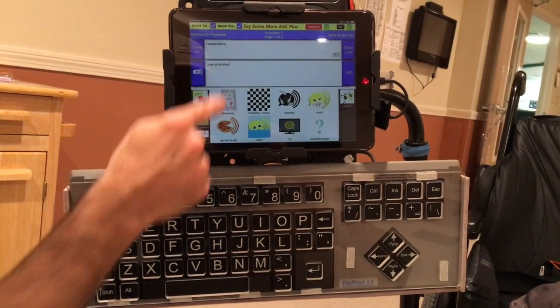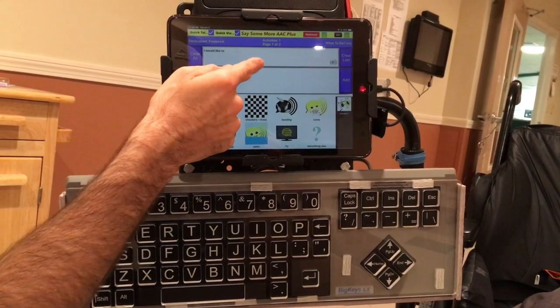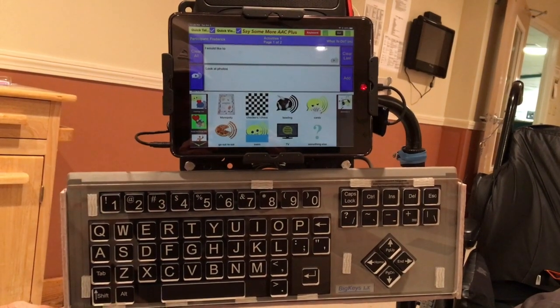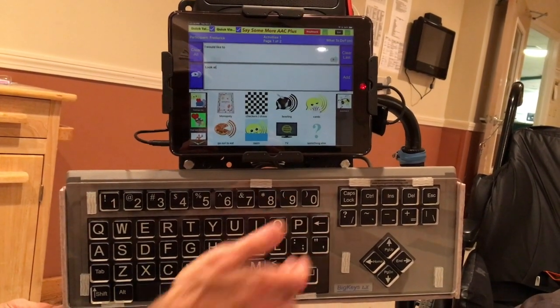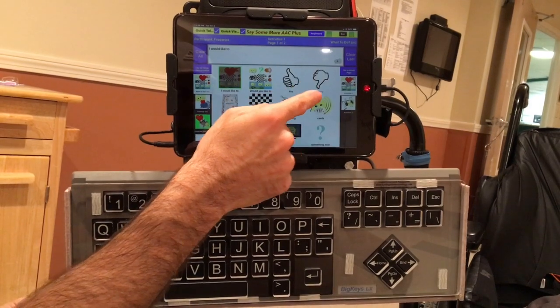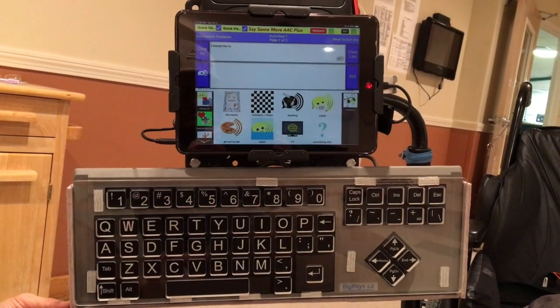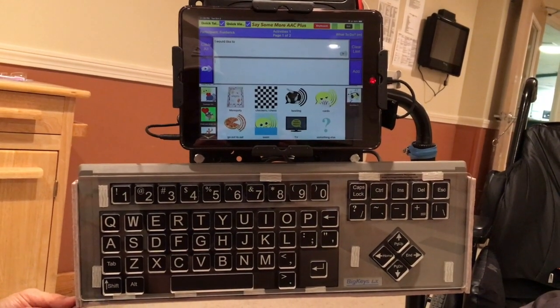So he could say, I would like to. Look at photos. Yeah, it's a little bit different. So you touch in the white box, I would like to, and then you touch in the icon here. Look at photos. And you can do backspace to delete, or if you want to delete a whole bunch at once, you press the red keyboard icon and it disappears, and press it again, and now it reappears. So it's blank. So that's a quick way to delete all of it. So that's using the keyboard.